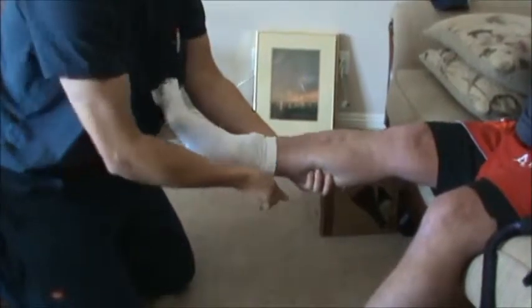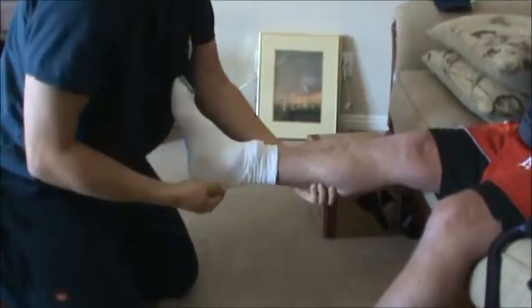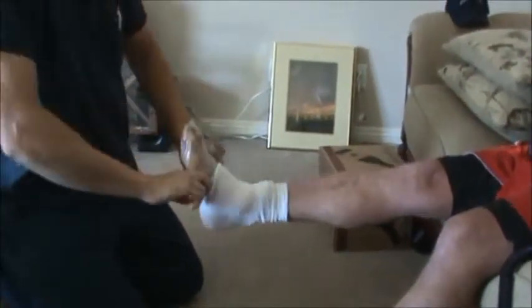Once you get to this point, grab the back of the heel, support the leg, and slowly pull over the heel — that's where we missed it. Once you get to the edge and the toes are here, pull the toes down.